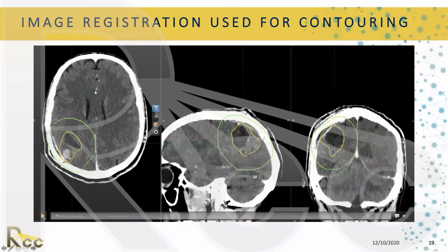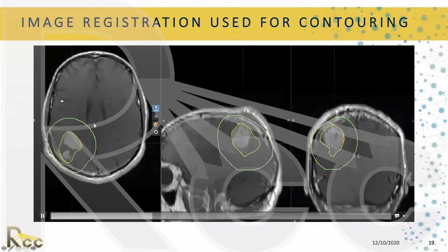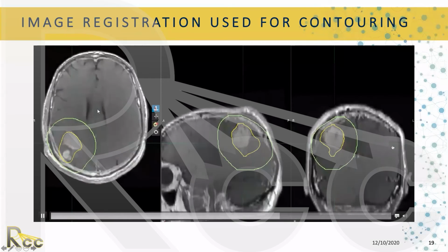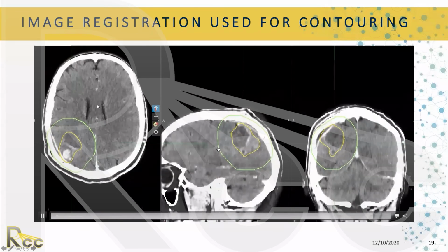You can see it's a brain, and you can see the CT, you can focus on the ventricle or in the brain and the fissures, just to make sure. And then you should look at all the coronal and the sagittal, because you want to make sure there are no rotations, and of course the translation, but you want to make sure that it is good. Here, sorry, that's good.